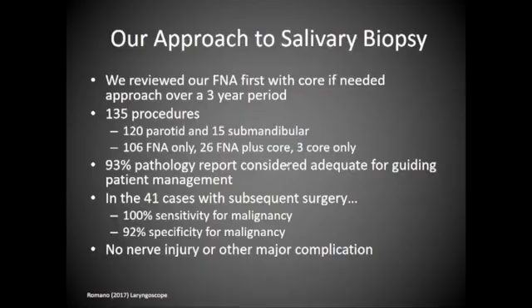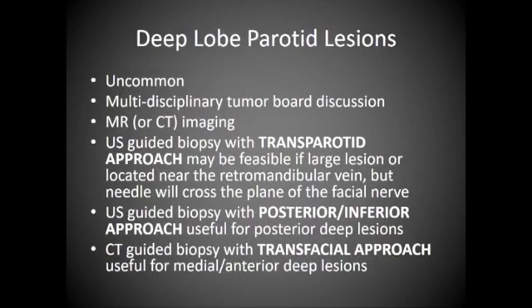We reviewed our experience with this FNA first, core if needed approach, which we recently published. Over a 3-year period, 135 procedures, we only cored about 25% of patients, and we had 93% diagnostic pathology, have not yet identified any missed cancers in that group, and had no significant complications. But again, I am blessed to work with some excellent cytopathologists, and this would only work if you have complete buy-in of excellent cytopathologists.